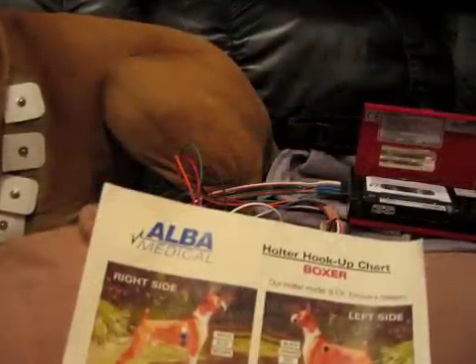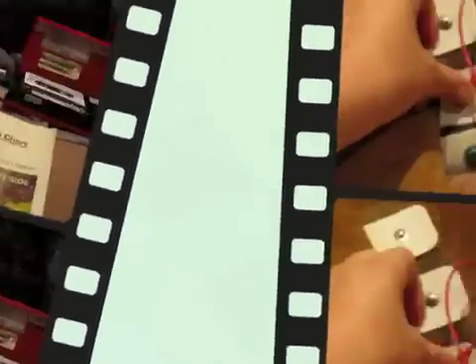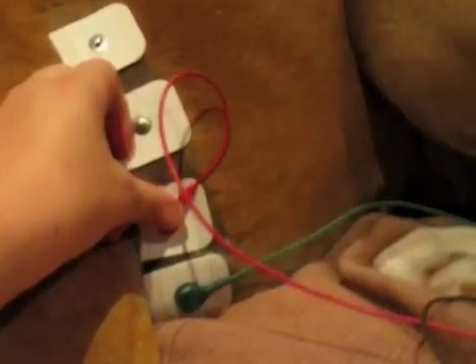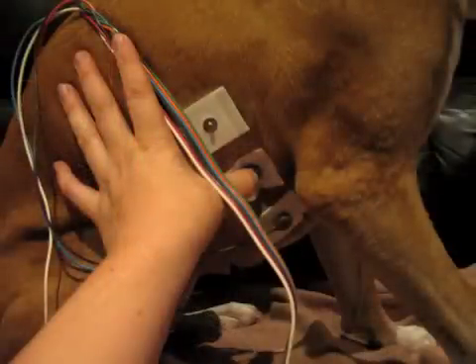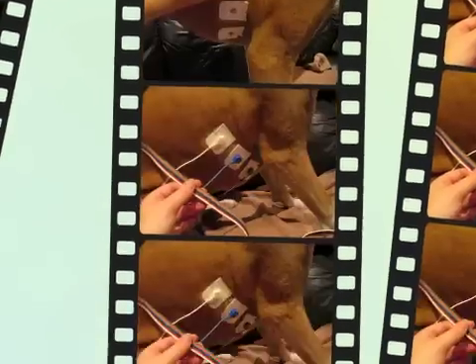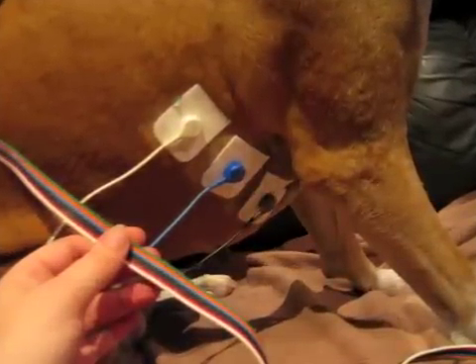I'm putting the tape in and checking the instructions for how many leads and what colours to put on each side so that I can start to attach the wires correctly. Following the instructions from the manufacturer, I'm now attaching the leads in the order and colours that the instructions tell me. So I've done one side; this is the second side being done now. You have to press quite firmly — make sure they click into the little metal button on the electrodes that are stuck to the skin. That's the second side done; on my machine it needs 3 electrodes.